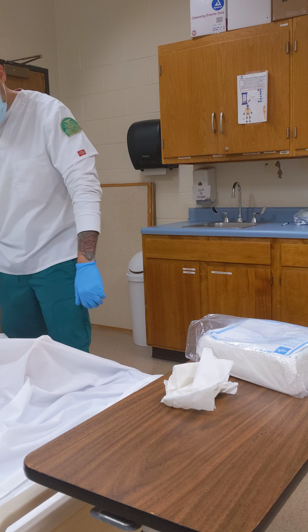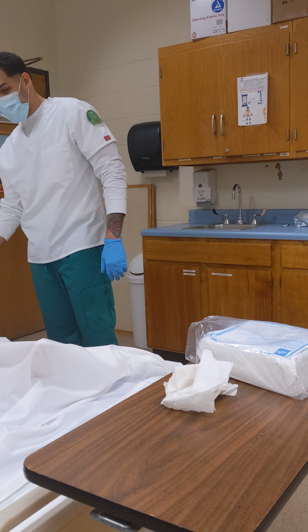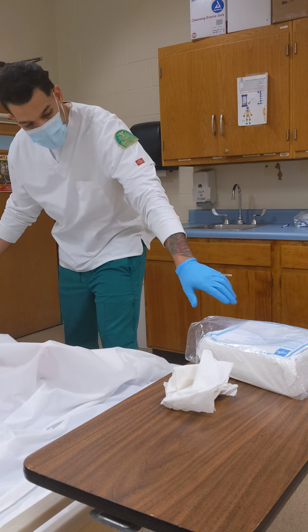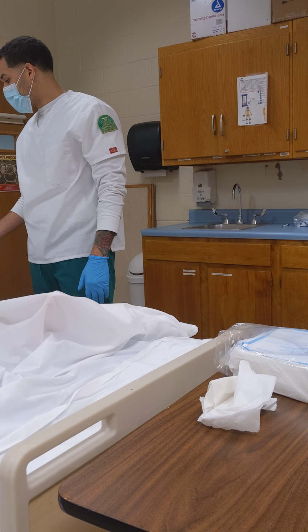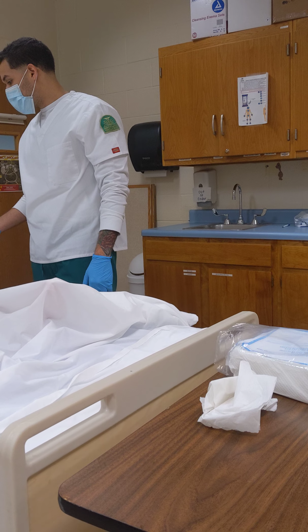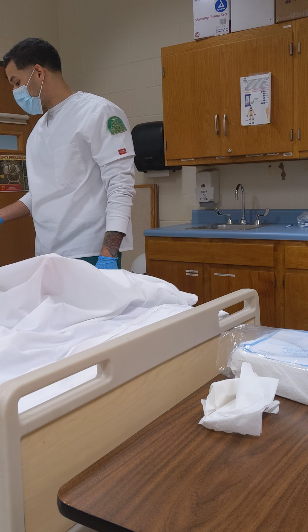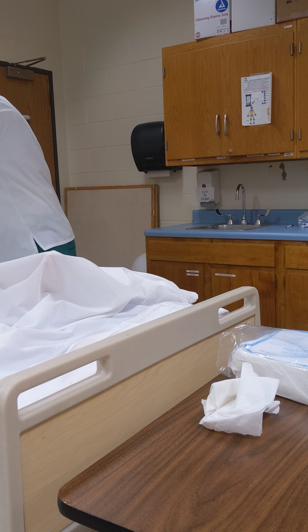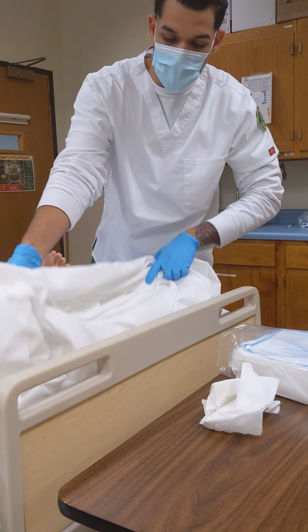I would then begin by raising the bed to an appropriate height. Let the patient know that I'm raising it for my safety and theirs. I'm going to begin by letting them know I'm removing the top sheet so that their entire legs are exposed.